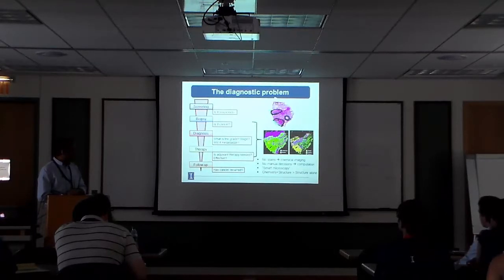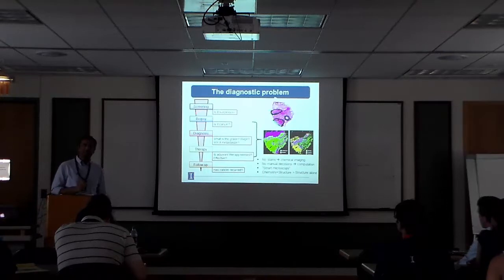What we have done here on the left-hand side is actually color-coded the tissue for different cells. So the green are all epithelial cells. The pink are all the non-epithelial cells, which we collectively call the stroma. The reason is because this is prostate tissue, and almost all cancers in the prostate arise in the epithelial cells. Okay? So what we're going to do is identify where cancers can possibly arise, and then computationally suppress everything else.